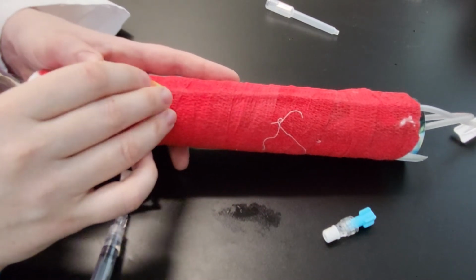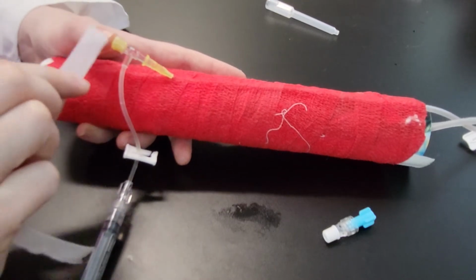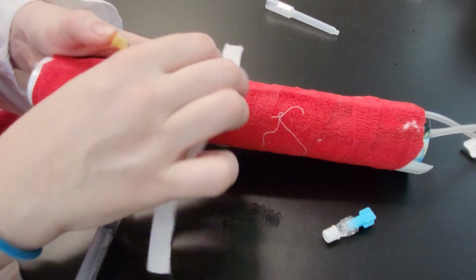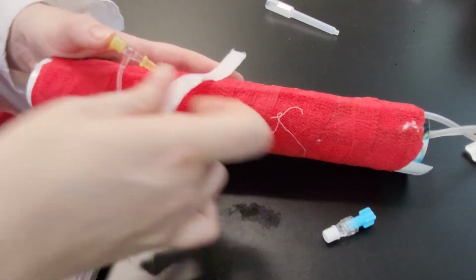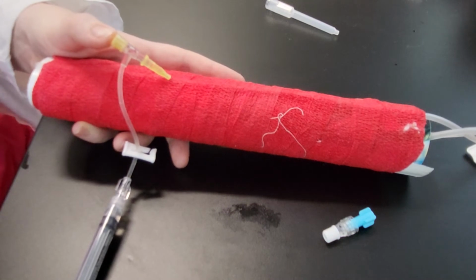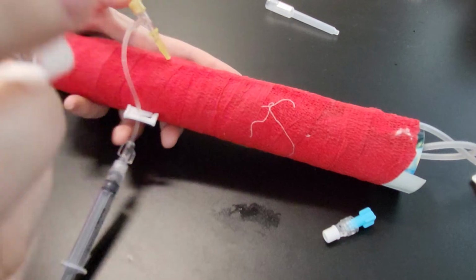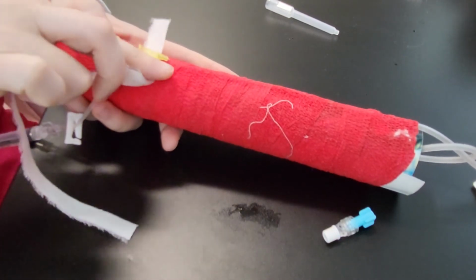As you know, I've ripped my tape into pieces for my first go. So I'm going to take one of my 1-inch pieces of tape, and I'm going to place it so that it is sticky side up and underneath the hub of the catheter.